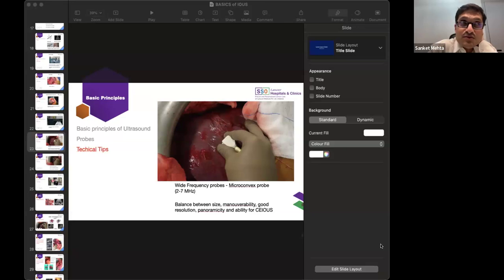Also, sometimes it can be used for metastatectomies in the lung, although it's not as performant for the lung as the liver and kidney, but it can sometimes be used. And I think the CVTS surgeons also regularly use it during valve replacement surgeries and pediatric corrective surgeries. It's also used in neurosurgery very commonly, and I think, if I'm not mistaken, some of these probes originated by first being made for neurosurgery and then their use being adapted in the abdomen.